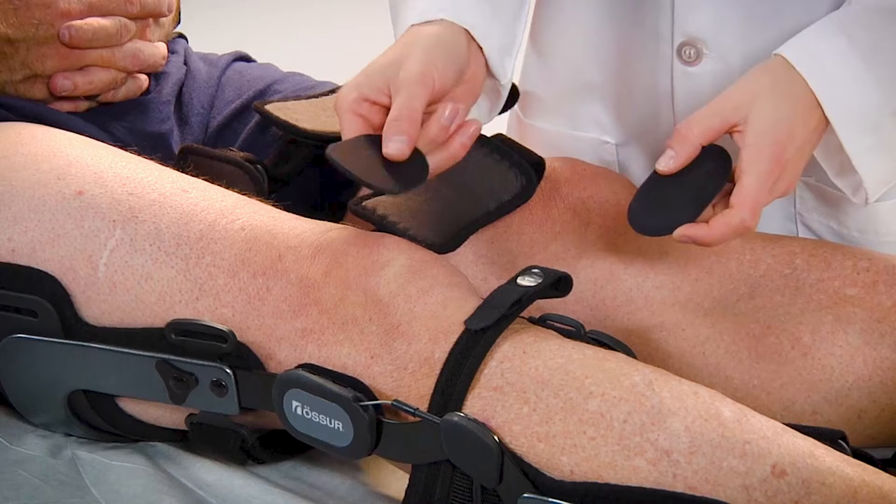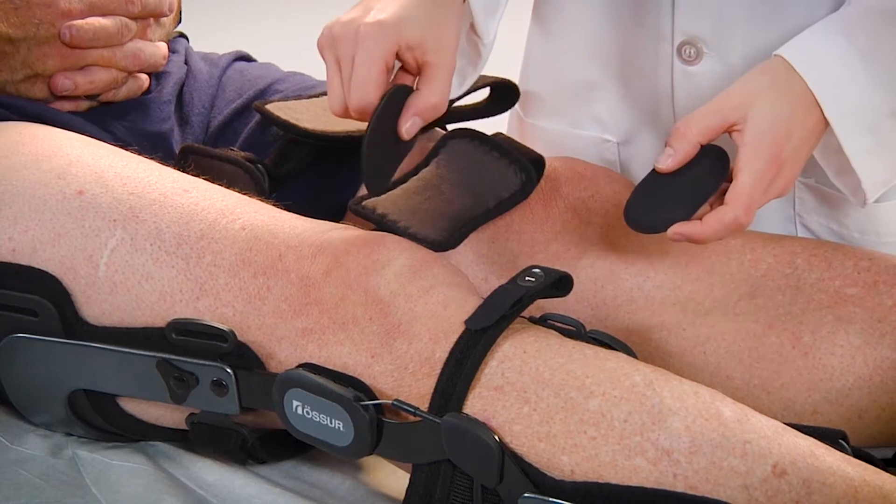The device is preassembled with thick condyle pads and is included with thinner sized condyle pads, along with a hook and loop shim. Use any combination of the condyle pads and shim to widen or narrow the width.